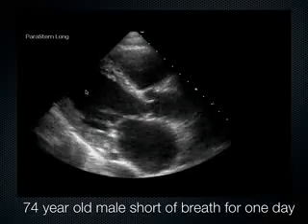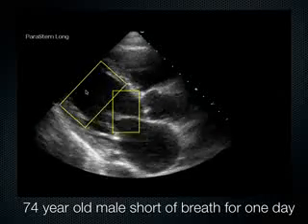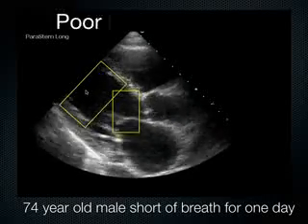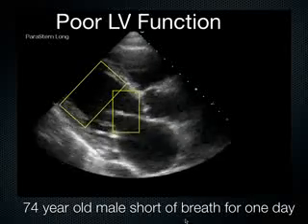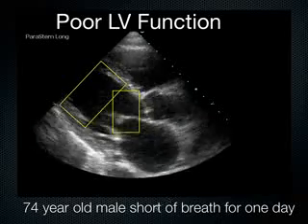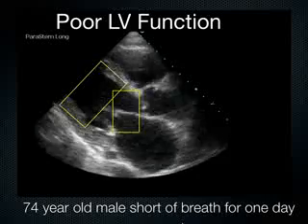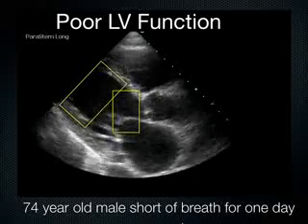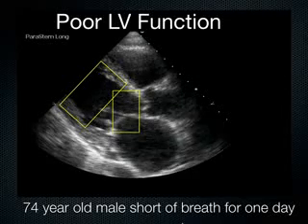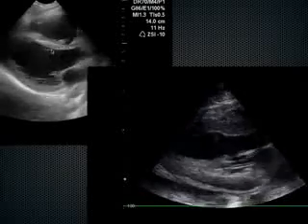towards my arrow there. So in this case, this patient has poor LV function, and I know that I'm going to need to be very judicious with the use of fluids, especially if they have shortness of breath. Okay, so this patient may only get better when given inotropes to help that heart squeeze better, and I have very good direct visual evidence of that. See, because normally that mitral valve should come up and smack that septum. Can you see that there?